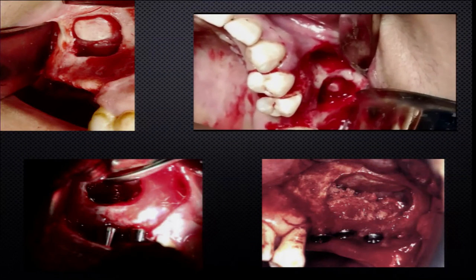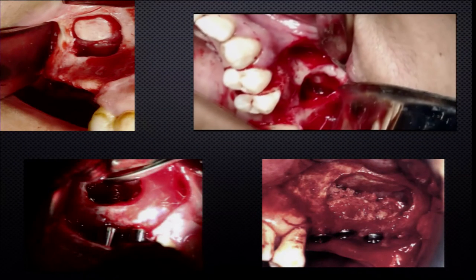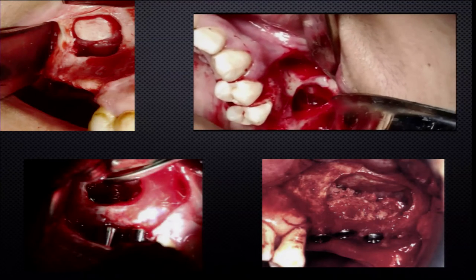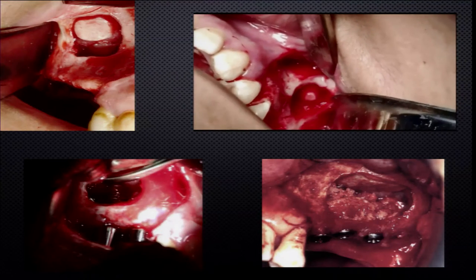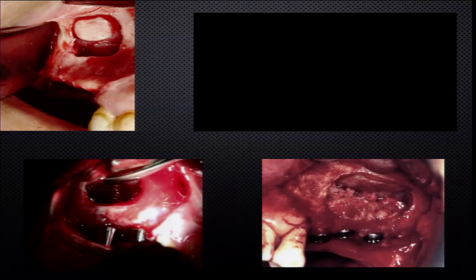Different window configurations are possible. We can check that the sinus membrane is intact — this can only be done under local anesthesia, since under general anesthesia air doesn't come out of the maxillary sinus. This valsalva-type check is the only reliable intraoperative test that open sinus lifting was performed while preserving maxillary sinus integrity. In a staged approach, we can ensure sinus integrity from the smooth upper boundary of the bone graft on CBCT — a smooth margin means the membrane is intact; bone particles spreading inside the sinus indicate perforation.